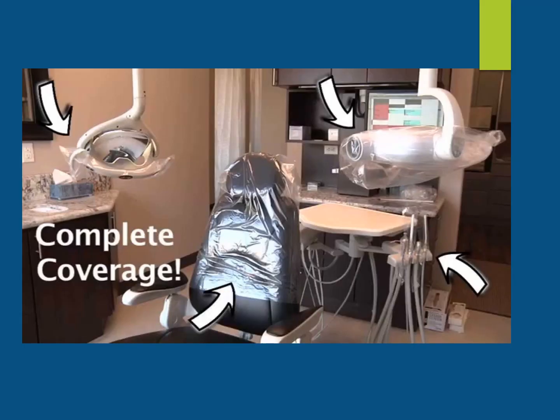And although this is not one of the units in our dental clinic, as a front view, it shows, okay, here's light handle covers with this area. There's a barrier cover here. Here's the suctions that are covered. The x-ray tube head is covered also, and that's in our x-ray area. You will always see those covered as well. Those are any type of touch and contact surfaces that we have.